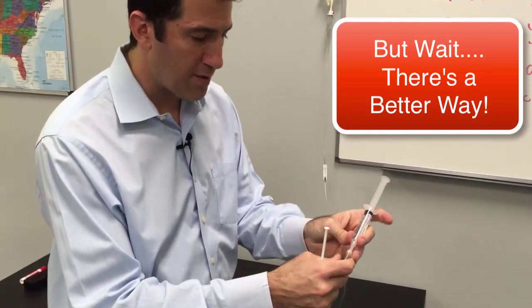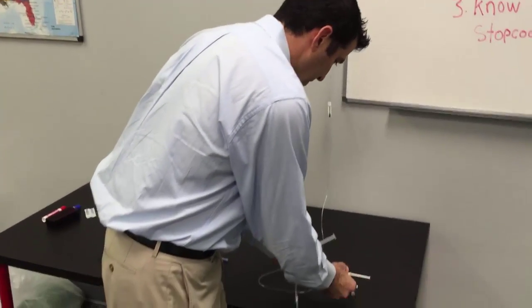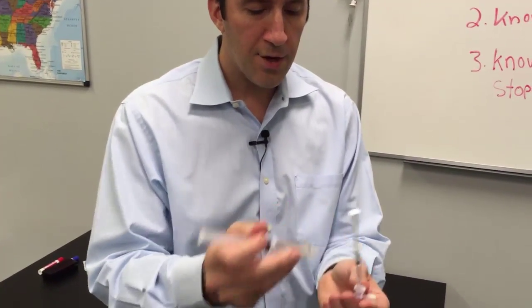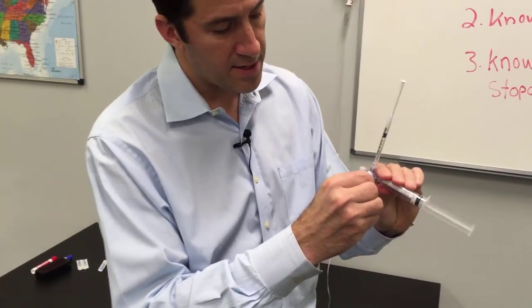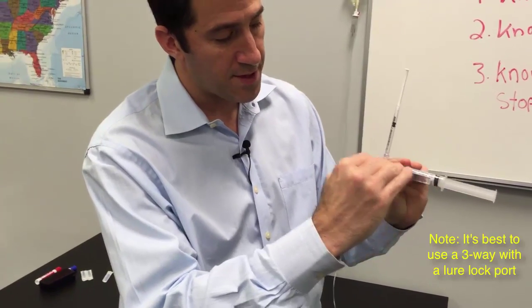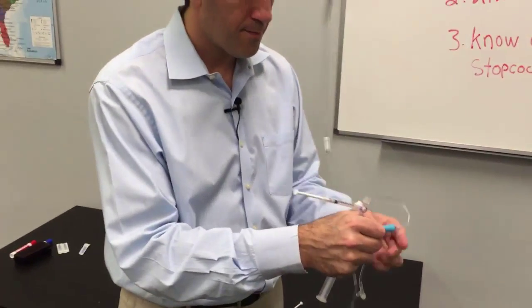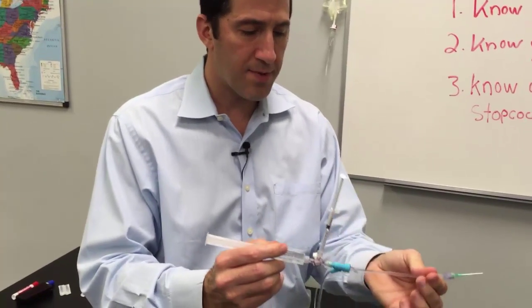But there's a better way. Let's take this off and show you how to set up this whole system with a three-way stopcock. Here's your adenosine — that goes here. Here's your flush — that goes here. The key is to have this off to nowhere, meaning it's a completely open system. We can come to the luer lock port right here and simply attach the whole concept.